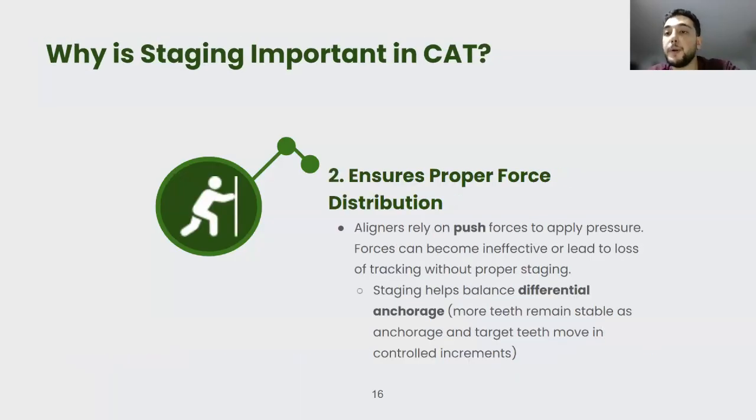Second of all, it ensures proper force distribution. So aligners rely on push forces to apply pressure. Forces can become ineffective or lead to loss of tracking without proper staging. Again, this is what we said. Staging helps balance differential anchorage.